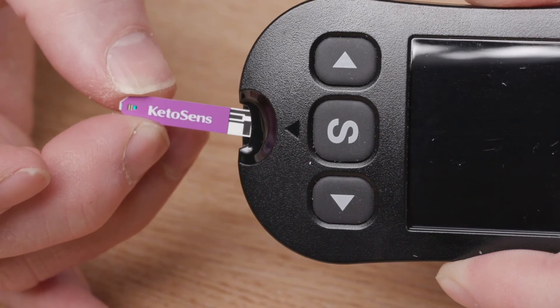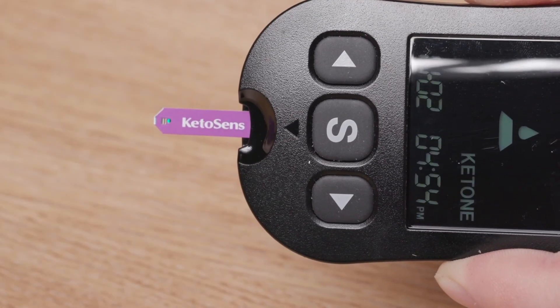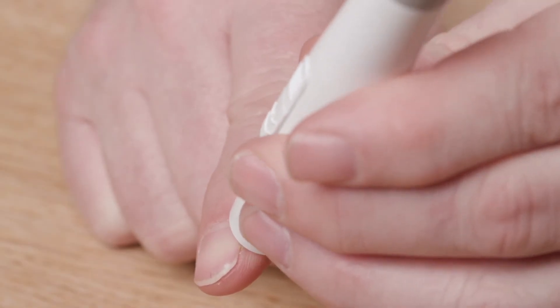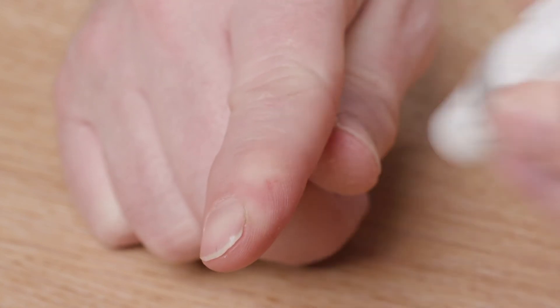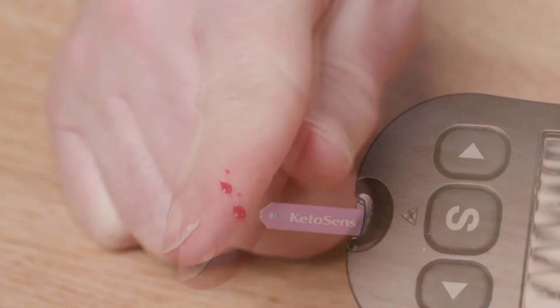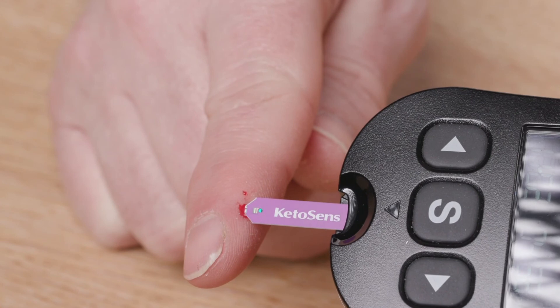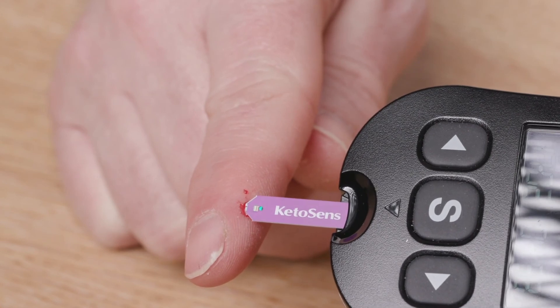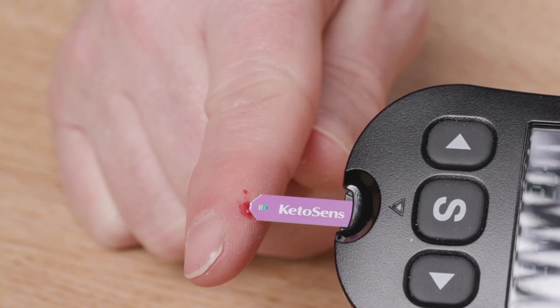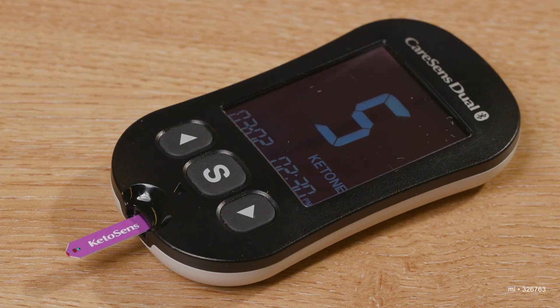I will now demonstrate a blood ketone test. Place the strip into the meter — this will switch the meter on. Place your lancet device to the side of the chosen finger and push the grey button. Squeeze your finger to produce a blood drop. Place the test strip to the side of the blood drop and allow the strip to absorb the sample. The meter will bleep to make you aware that you have an adequate sample. The meter will count down and the result will appear on the screen.